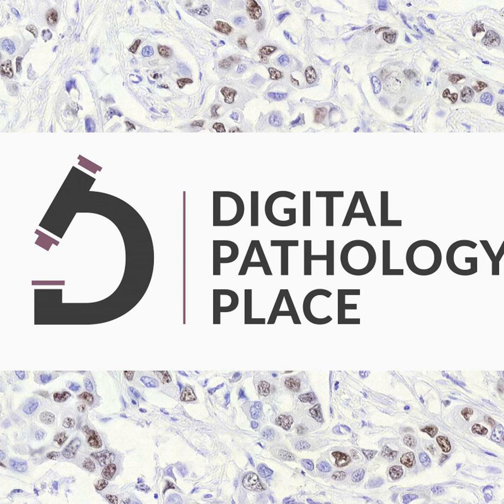And we can see here that, due to some limitations of the scanning, FDA does not consider the resulting digital image to be an exact copy of the glass slide. It's not an exact copy, but they're basically telling us it is good enough. There is a term, faithful replica. It's good enough to generate data on, to generate a pathology report on.